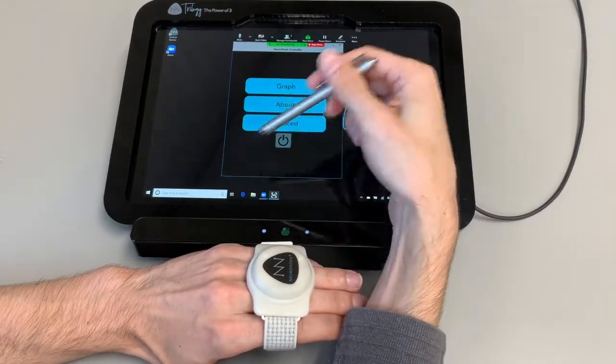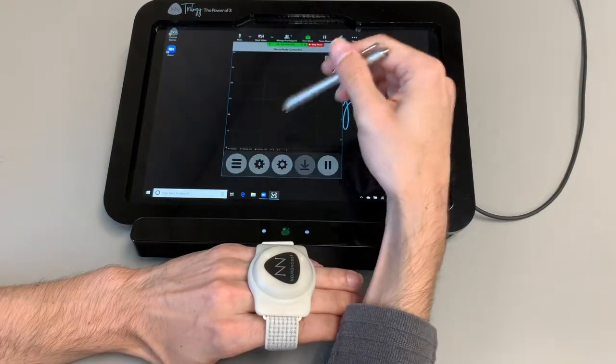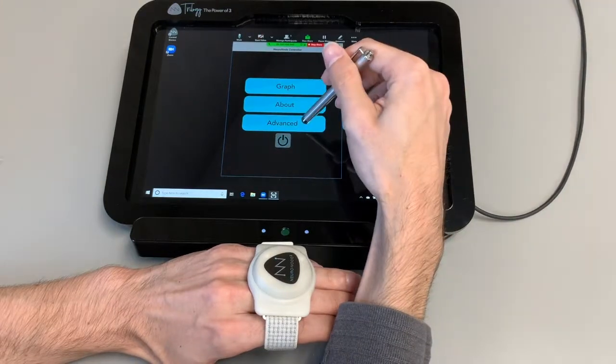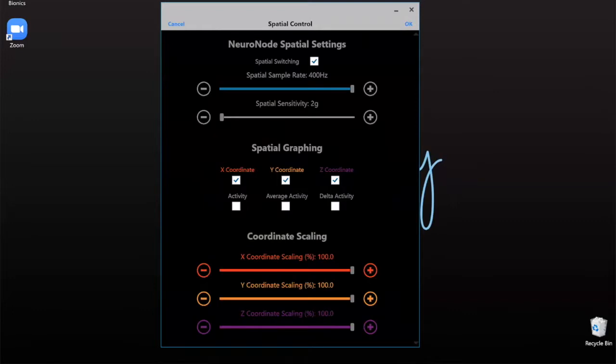So what I'm going to do is get rid of all that extra information. I'll press that bottom left button — this hamburger menu — go into Advanced, and that's where our spatial control is. Now you won't see all of your settings here; this is basically just to affect what is displaying and what's being recorded. So we want to go ahead and turn off the red line and the purple line. This is the Z coordinate and X coordinate — we're going to turn those checkmarks off because we're focused on that orange one.